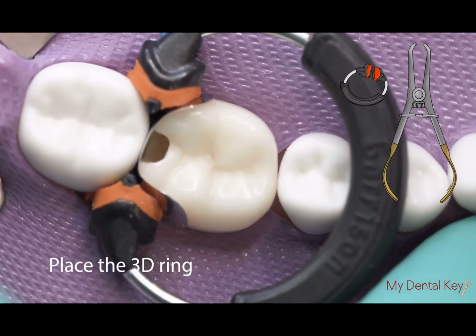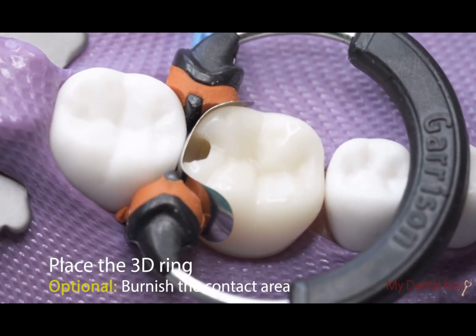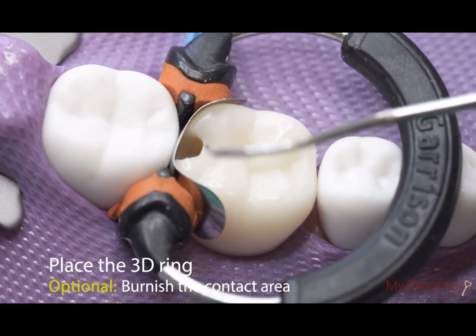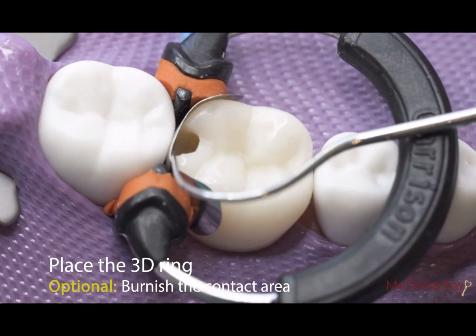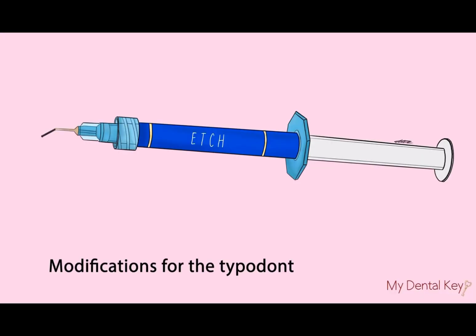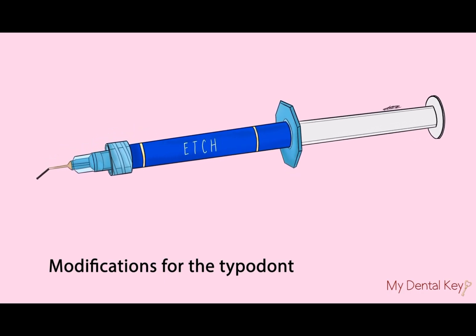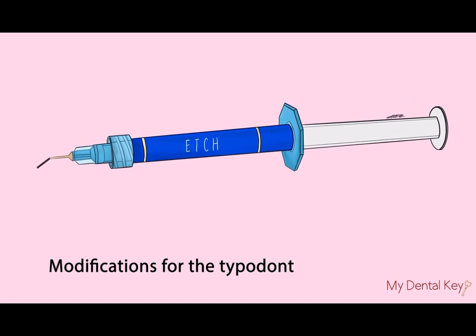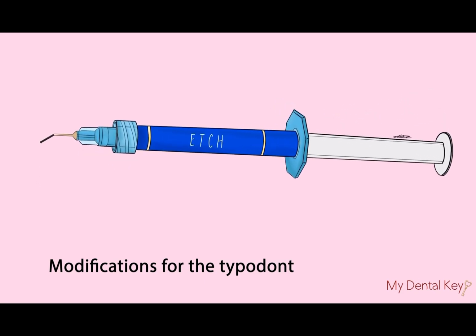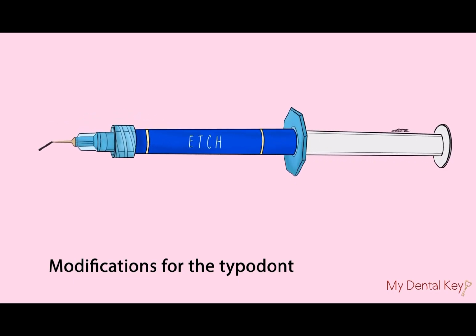Before proceeding to the next step, ensure that the gingival margin is completely closed. Though not strictly necessary with a sectional matrix band setup, it can be helpful to burnish to ensure an appropriately sized contact. When working with typodont teeth, it is not necessary to use etch to prepare the preparation for the restoration. As a result, we chose not to use etch in this video. However, if performing this procedure on a live patient, it is crucial to use etch prior to using bond or to restoring the tooth with composite.